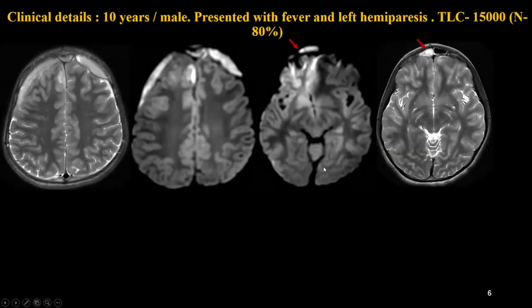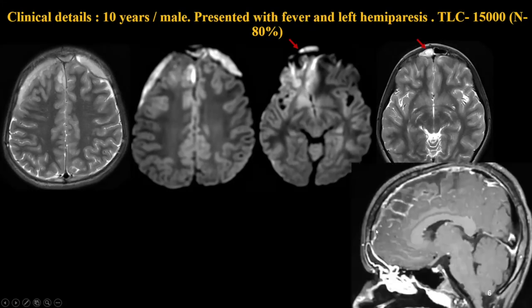A companion case: this 10-year-old presented with fever and left hemiparesis and was actually sent to us for evaluation of stroke. The TLC counts were raised. We have diffusion-restricting subdural empyema at bilateral subfrontal convexities and the interhemispheric fissure. Importantly, there is also a collection in the right frontal sinus showing diffusion restriction — this should be given much importance. There is some diffusion restriction in the right basifrontal area correlating to the patient's symptoms. The sagittal image shows the peripherally enhancing subdural collection and enhancement of the frontal sinus — again, subdural and extradural empyema secondary to frontal sinusitis.